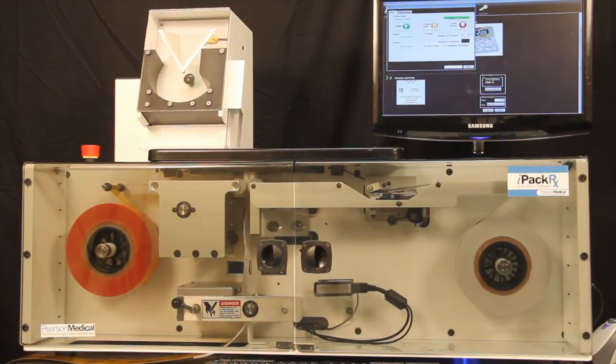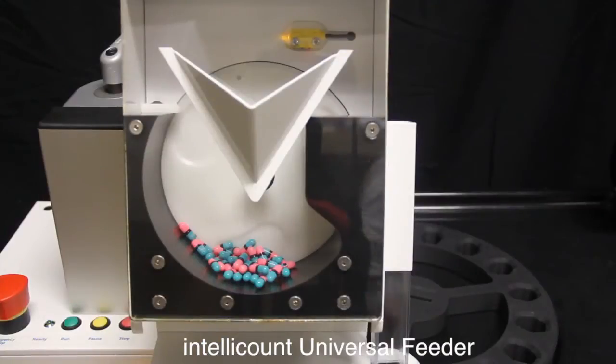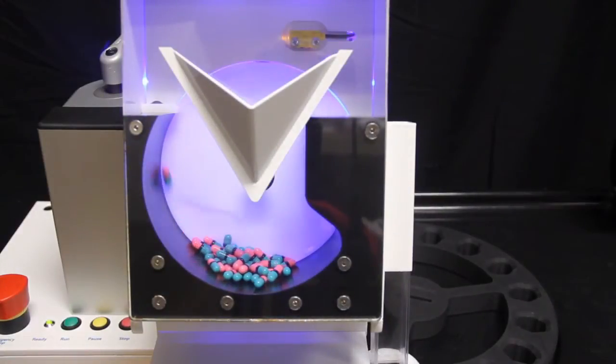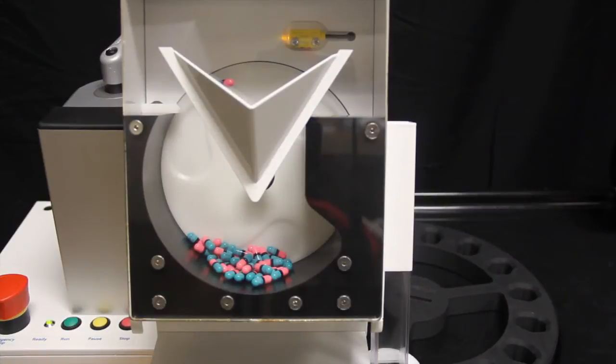With the IntelliCount feeder, a technician can simply pour in the medications, hit start, and walk away, freeing personnel to perform more demanding tasks for unprecedented productivity.